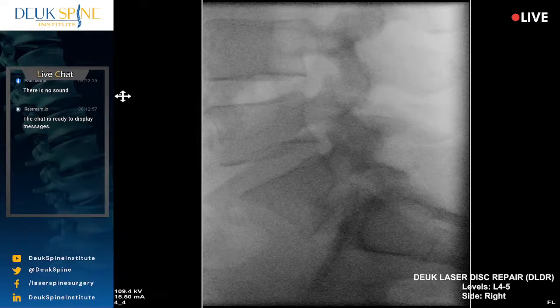Just line up L4-5 nicely. It looks good to me. All right, so let's show everybody the L4-5. Very good. And then the disc below, go to L5-S1 right there. Now, you can see the front to back dimension of that disc at L5-S1 is not normal. It's not the same as the L4-5. It's about 2/3 of the width, so it's not a real disc.